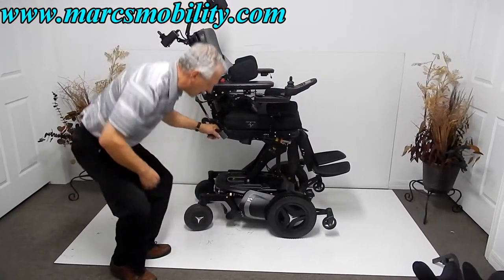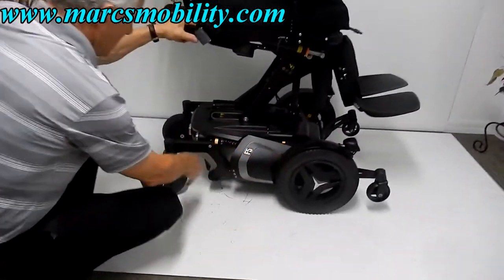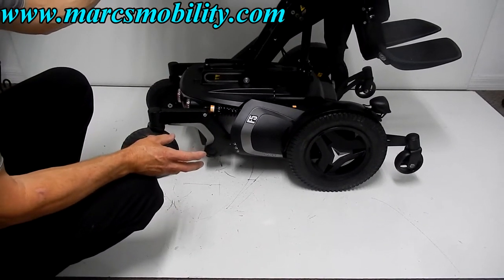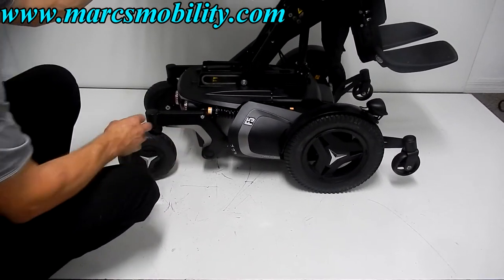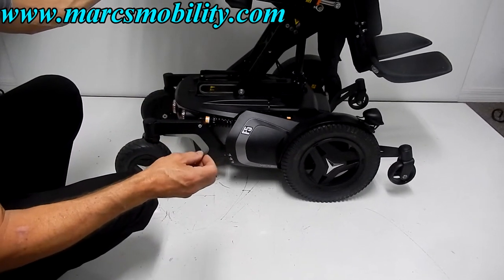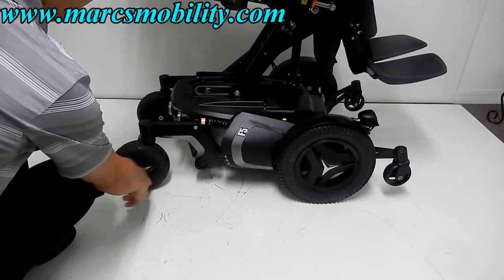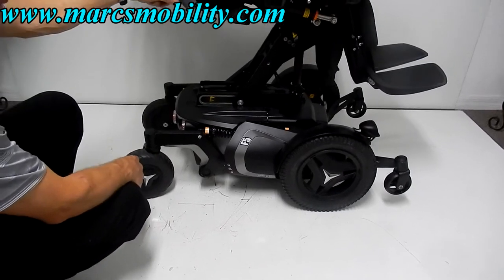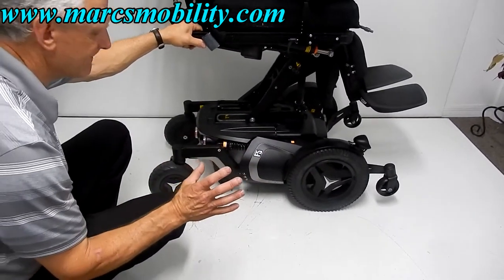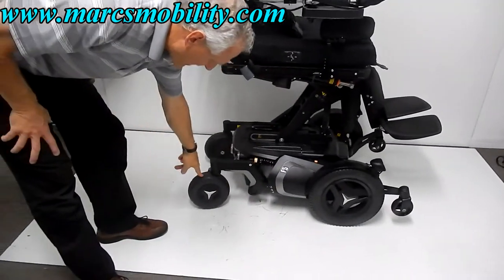With the seat elevated, let's talk about the drive wheels. There are 14-inch drive wheels and caster wheels in the back. The wheels were replaced on this chair — the back wheels had chunks missing, likely from hitting a minivan ramp improperly. We replaced both the drive tires and the back caster tires. These are new, heavy-duty tires.